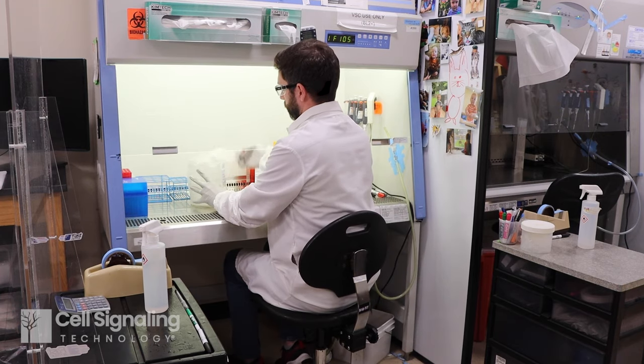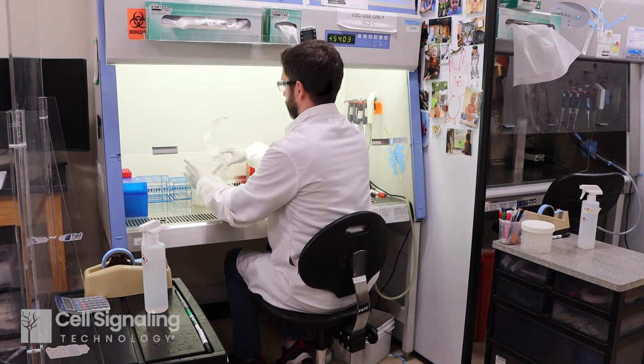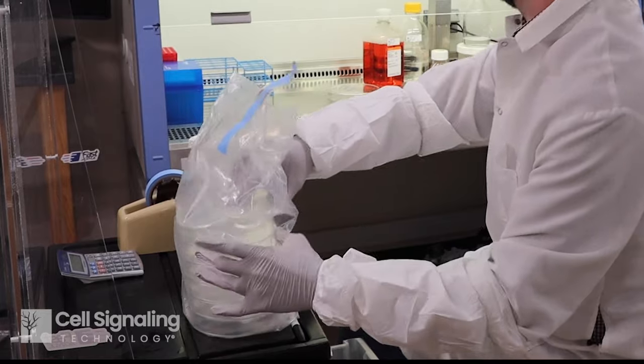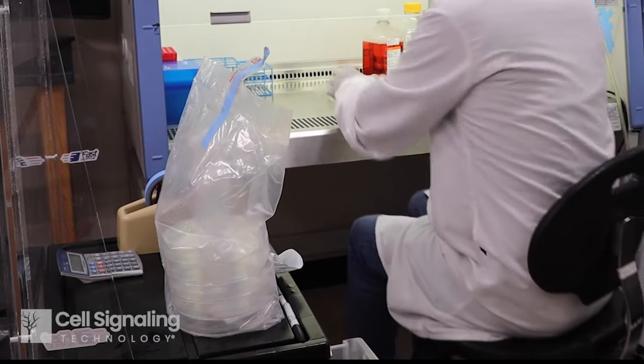Plastic consumables, liquid media, and other reagents for cell culture are available in sterile packaging. The sterility of these components is important, but the most crucial factor is your technique.